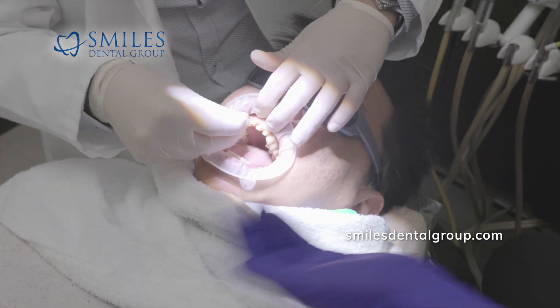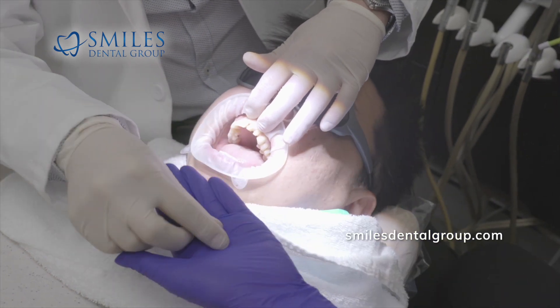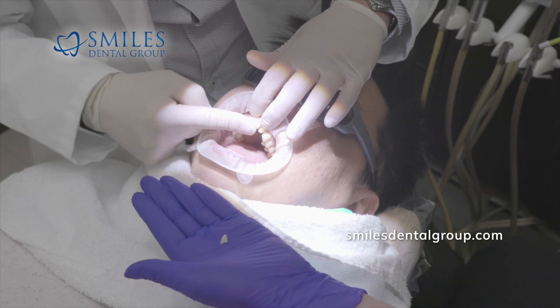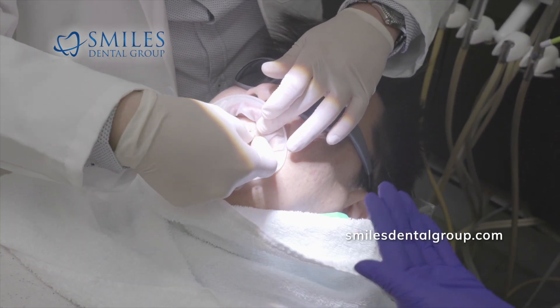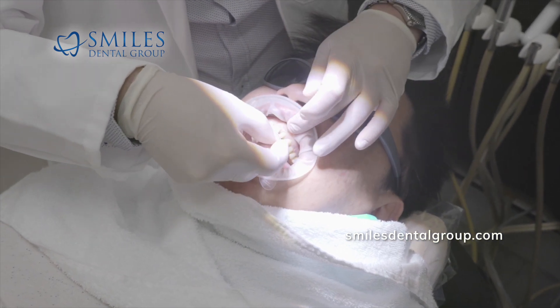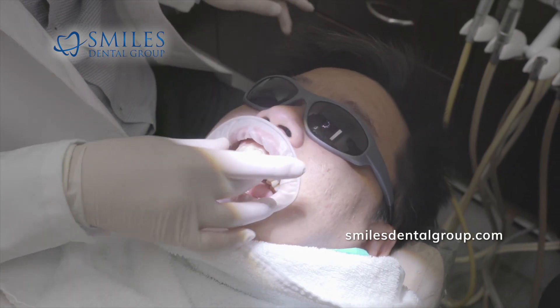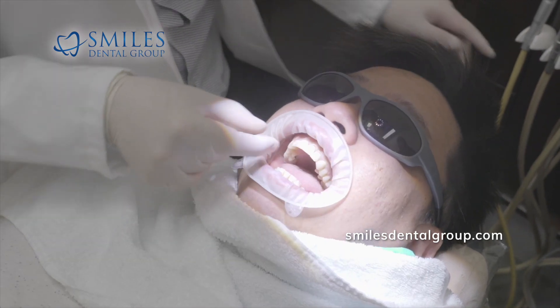We're confirming the sequence of inserting these porcelain restorations. Most of the time I'll go central incisors, lateral incisors, canines and so forth. In this case, because of the path of insertion, the easiest approach would be to start with the upper right lateral and then work our way to the left lateral.